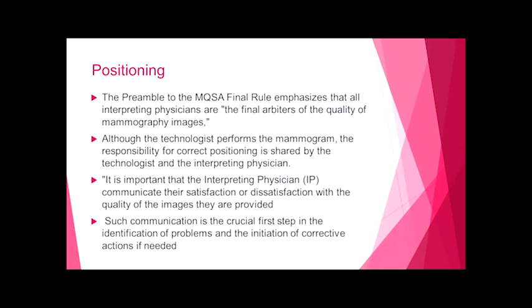So when we begin to talk about some of the reasons for clinical image deficiencies, one of the main ones, one we're going to discuss at length, is positioning. The preamble to the MQSA final rule emphasizes that all interpreting physicians are the final arbiters of the quality of mammo images. Although the technologist performs the mammogram, the responsibility for correct positioning is a shared responsibility between the technologist and the interpreting physician.